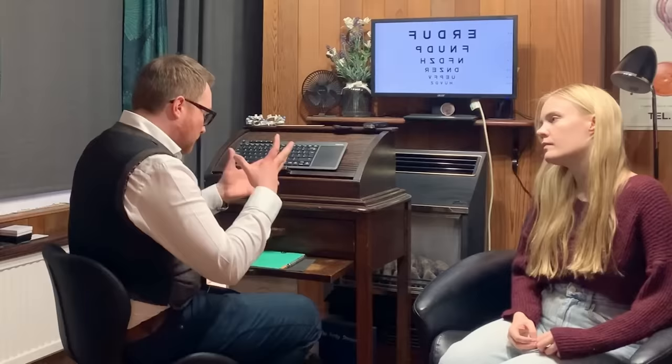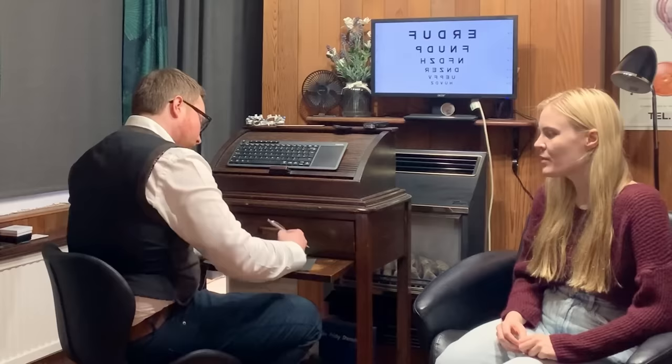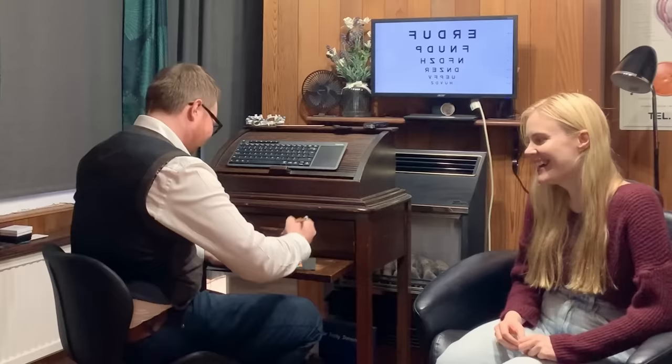Brilliant. Now, obviously, we spoke about work and you're spending a lot of time on the computer editing videos. It's quite important to understand what we use our eyes for, which sounds a bit of an odd statement. Are there any hobbies that you do, any close work, any sports, anything like that at all? I read a lot. Okay. But not necessarily on paper, mainly on my phone. Okay, just upping that screen time. Yeah, and when not editing or actually doing work, it's often watching YouTube. So again, more screen time.